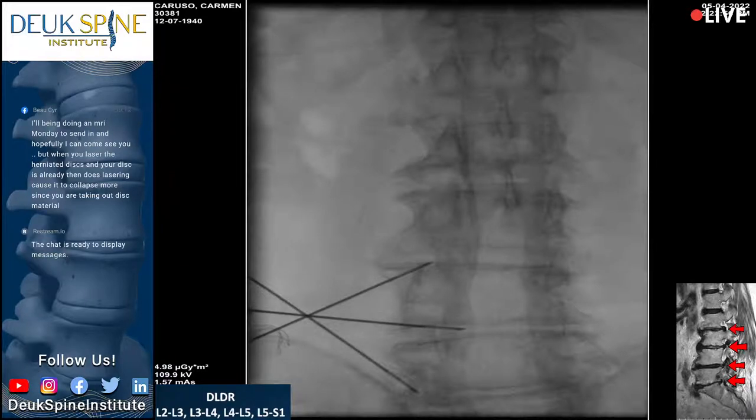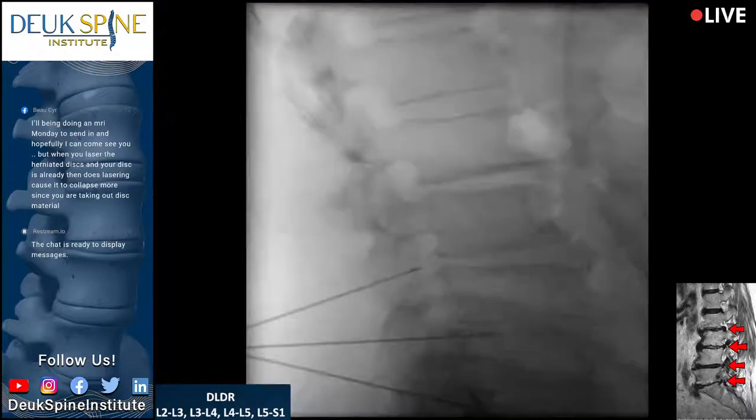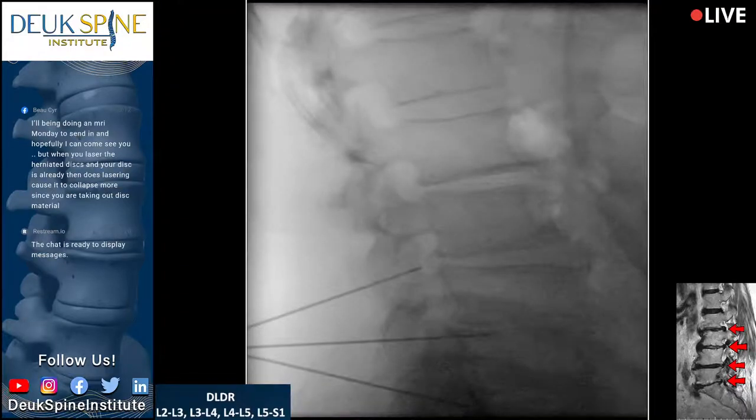Now this patient's unique. He actually has herniations on both sides at four discs. Show them the herniation at this level. You can see it right in front of the needle tip. There it is, right there. You guys see that with the white arrow? That is the herniation at L3-4. It's huge. And show them the herniation at L2-3, the next level up.